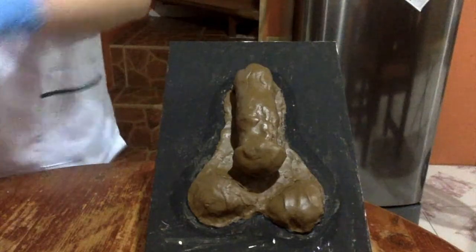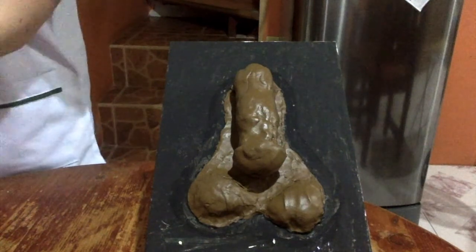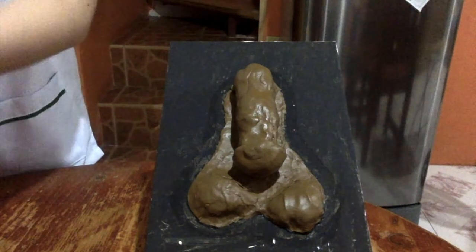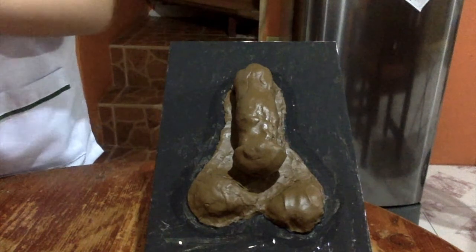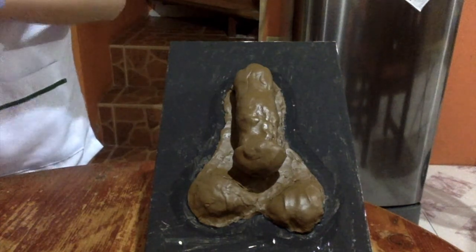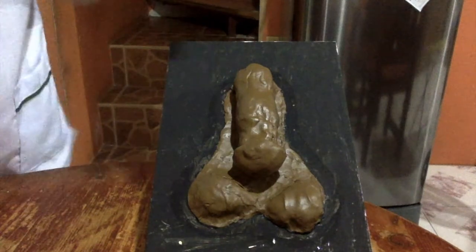I will now dip the first towel in the basin with warm soapy water. So I will be washing the tip of the penis at the urethral meatus first. Then using a circular motion, I will clean from the meatus, then outward. So this direction of cleaning moves from area of least contamination to area of most contamination. So it will prevent the microorganisms from entering the urethra.